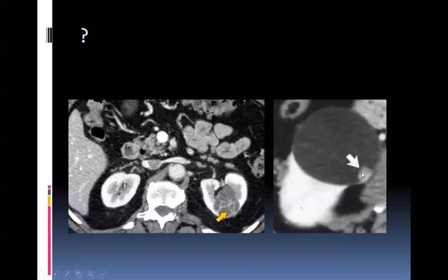Okay, so this is when you have a solid enhancement inside a cyst. This is obviously contrast given. The rest of the kidney is enhancing, so along with that, you also see some enhancement inside the cyst wall. So this is Bosniak 4. When you see any significant enhancement inside a cyst, consider it either going to be 4 or 3. So you cannot leave alone these cysts.